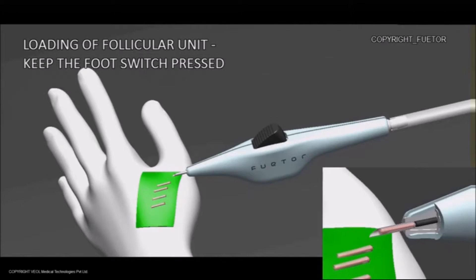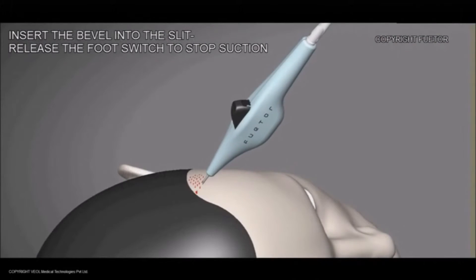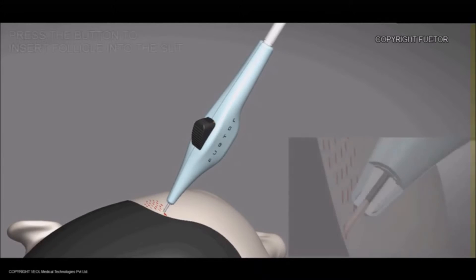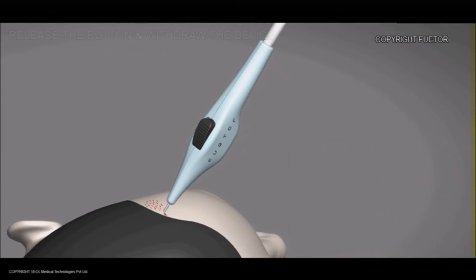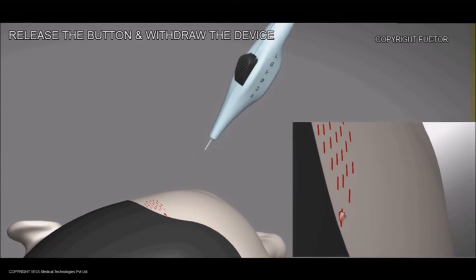Keep the pedal pressed until the graft is loaded, then release the pedal once the graft is loaded. Insert the bevel into the slit, then slowly press the button to deliver the graft. Retract the implanter once the button is completely pressed, and the graft is out of the transfer tube with its tip slightly visible.